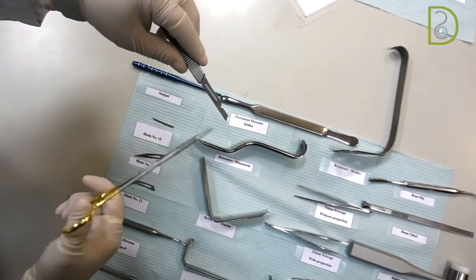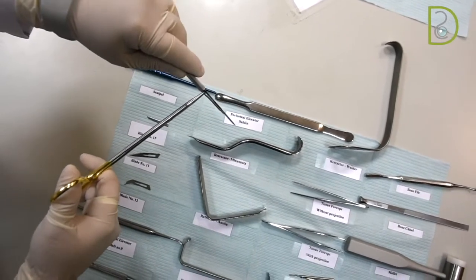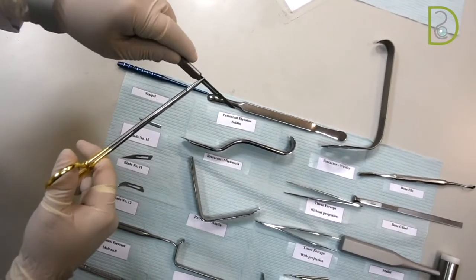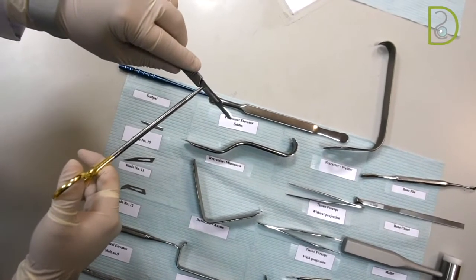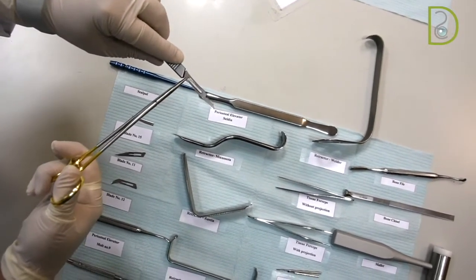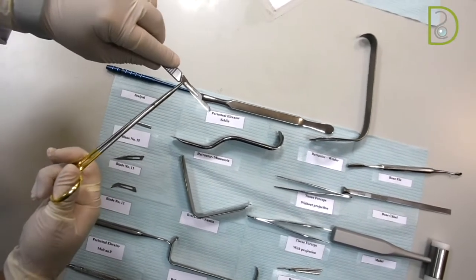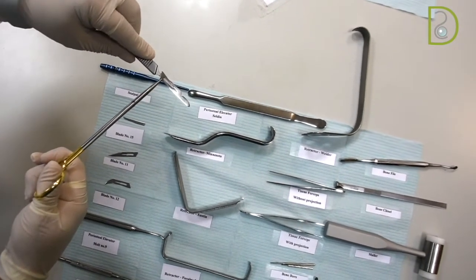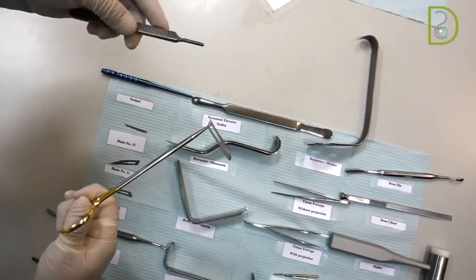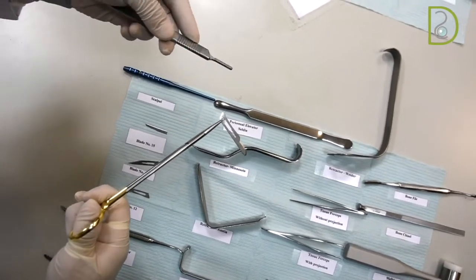Then you open. If you want to discard your blade, look at the edge that you can hold from the blade. Then upright it a little bit, lock your forceps and slowly take it out. This is how you will dislodge your blade from the blade holder.